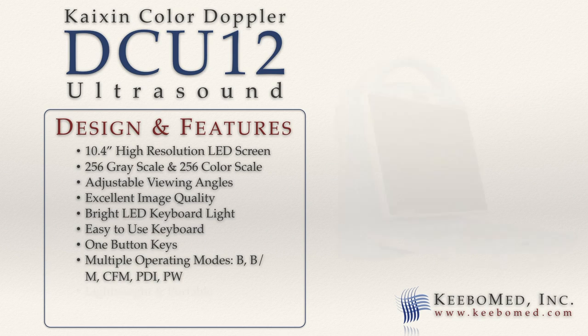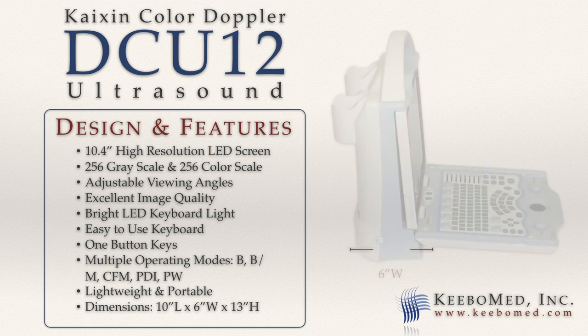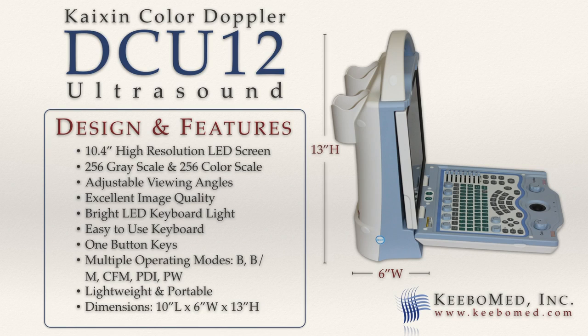It is lightweight and portable. It weighs only 12 pounds and has a sturdy carrying handle that allows for easy transport. The approximate size is about 10 inches long, 6 inches wide, and 13 inches high.